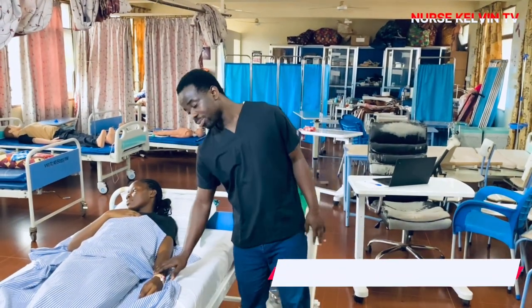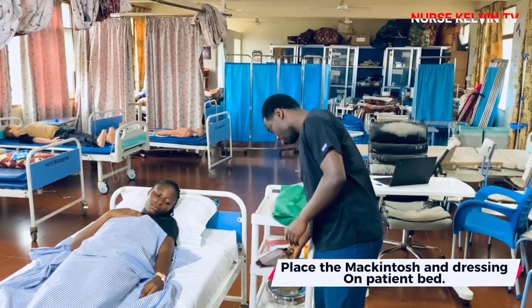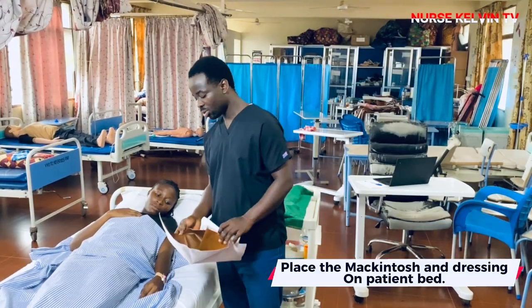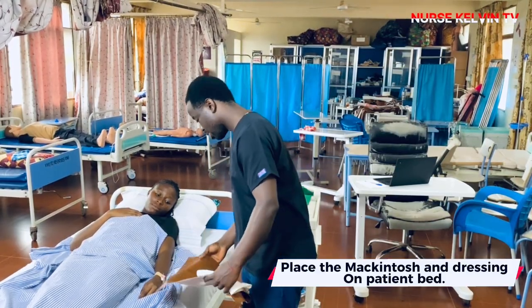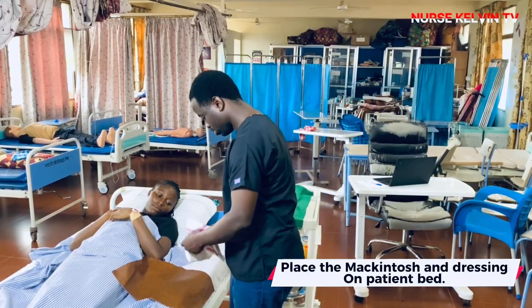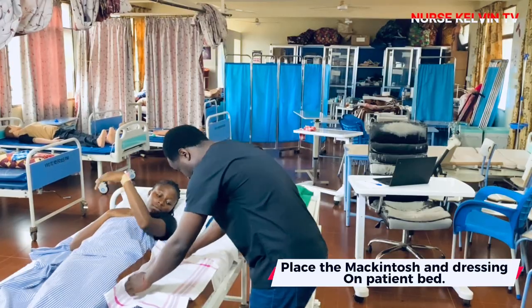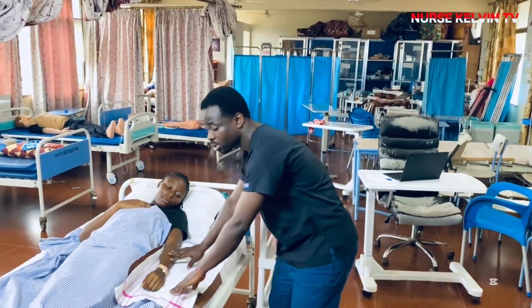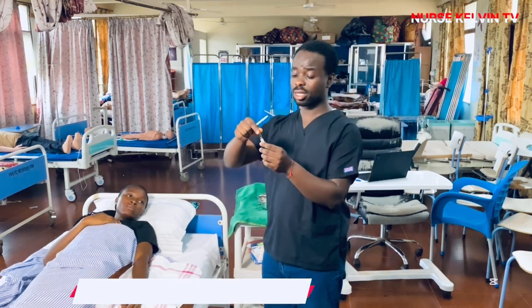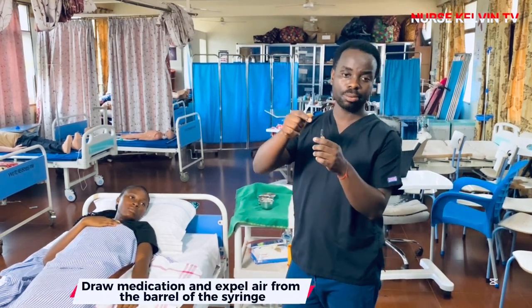So I have assessed the patient's site of the cannula. This is what I'm about to pick up. So guys, I'm withdrawing the medication. That is ampoule furosemide 40 milligram.